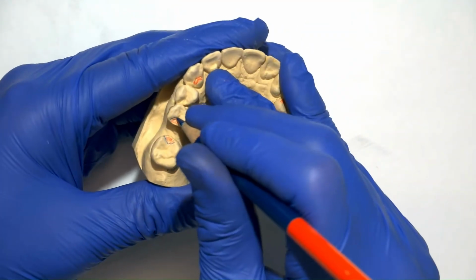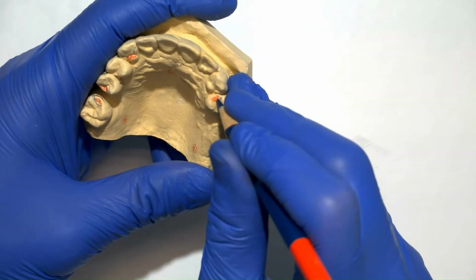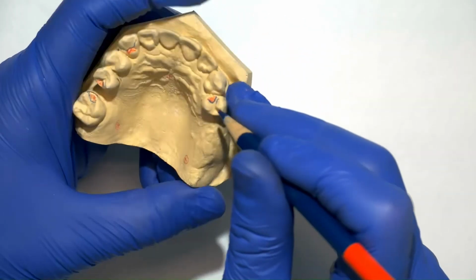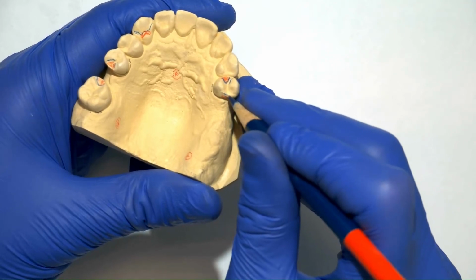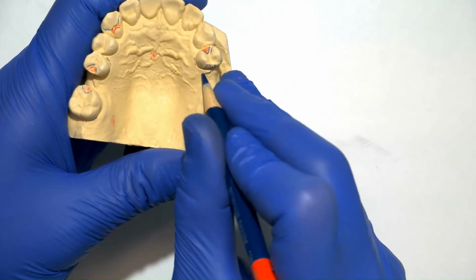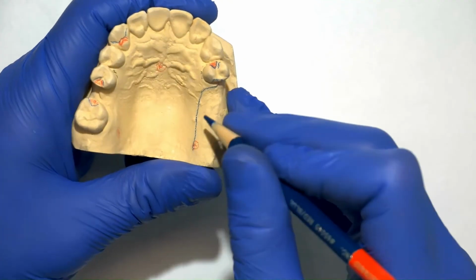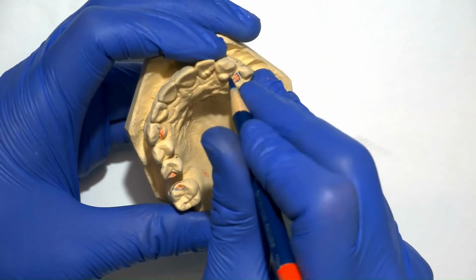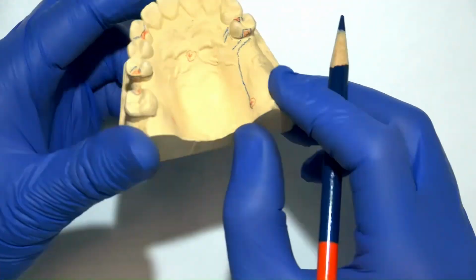We'll go ahead and follow the same steps we did on the paper drawing, starting by first outlining each rest seat like this. Then we'll go ahead and outline the guide plane like this here. Now the last minor connector next to the edentulous space gets extended all the way back as this becomes our finish line. Then dropping minor connectors down from each edge of each rest seat, just like that.